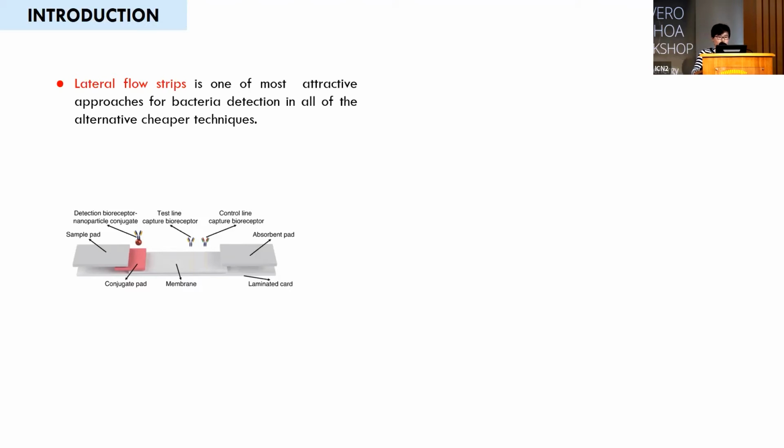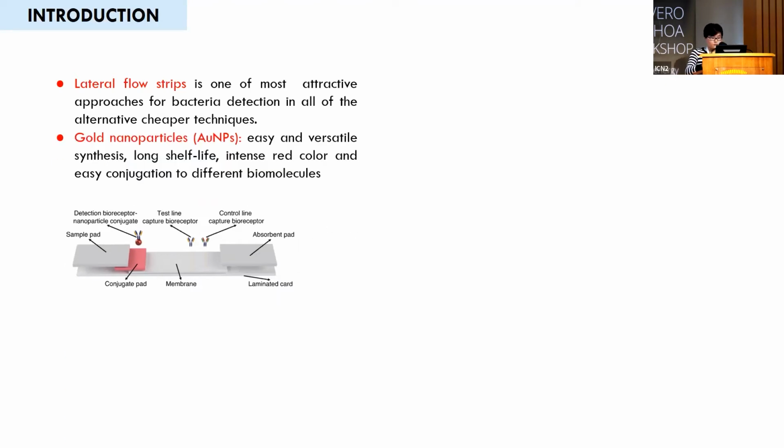So this strip is a paper-based biosensor. It has various pads assembled, and it is based on the capillary function of the absorbent part.